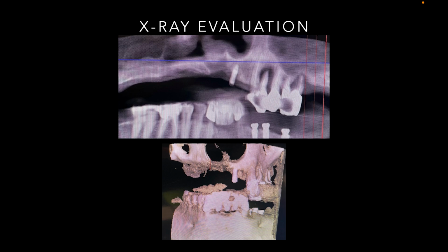Here's a very difficult case. The left side has some bone to work with, maybe putting a single implant in the front. And I'll show you this case when it was finished later. And maybe putting an angled implant in the upper left area, even though there's a big infection in that premolar region. But the right side, we have no bone. I mean, it's a flat area, very complex. We ended up treating that right side with a zygoma, pterygoid, and a short implant in that front area.